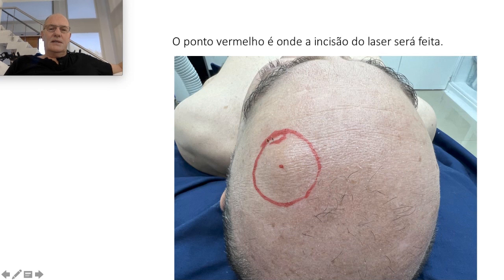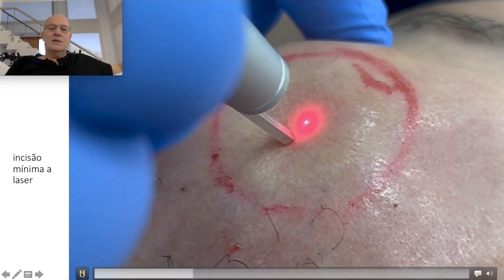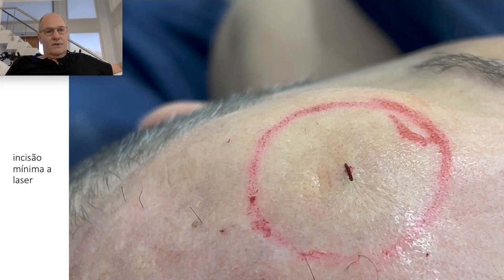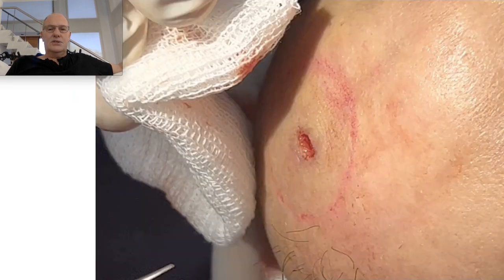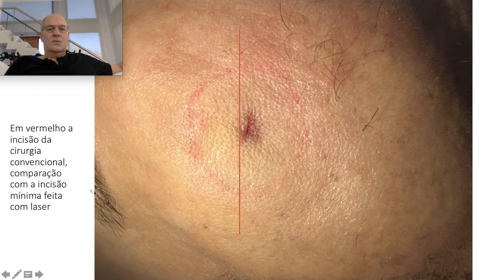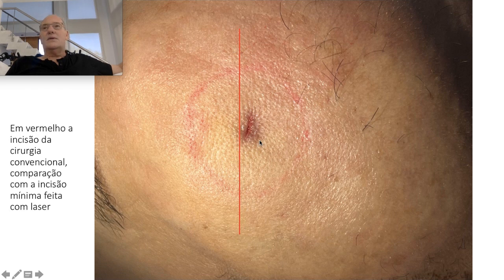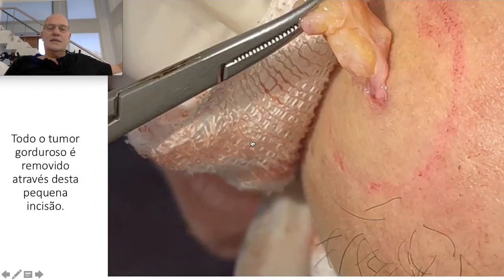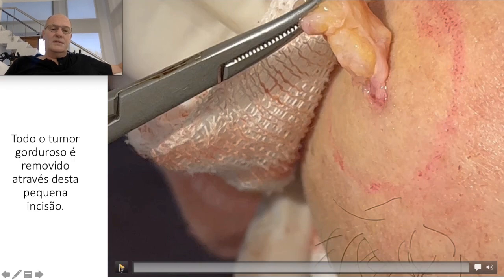Here in red we can see the size of the tumor, and I'm going to remove this lesion from a minimal laser incision here. We can evaluate how the laser cut of the skin is done from this small incision — from this small incision I'm going to remove the full tumor. This red line shows the kind of surgery proposed to this patient in Spain and other countries. This is a comparison with my personal technique, and here is how I remove the full tumor with this minimal incision.